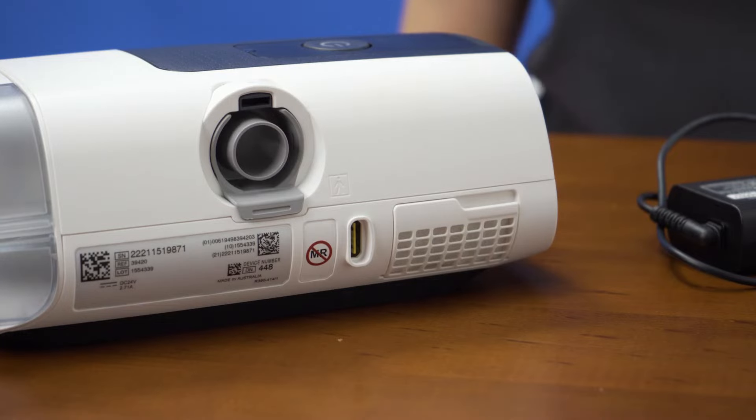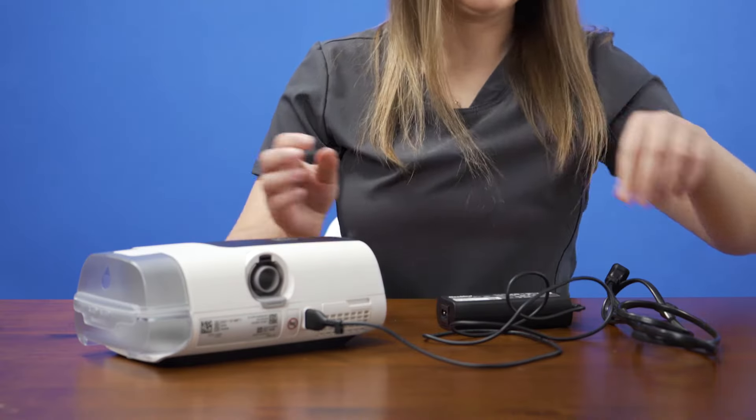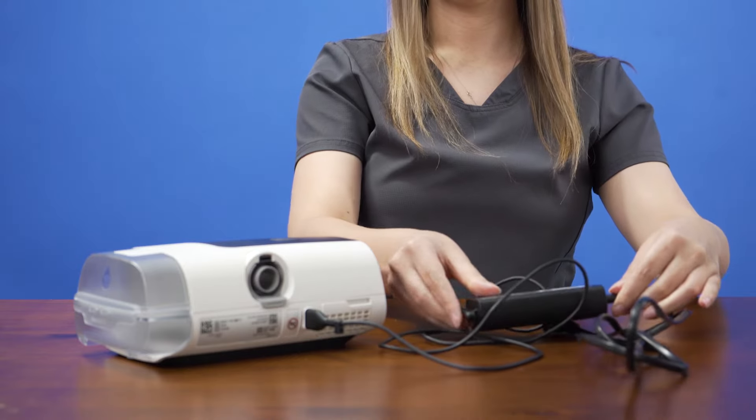Place the device on a flat surface and connect the power adapter to the DC inlet of the main device. Connect the power cord to the power adapter and plug the power cord into the power outlet.